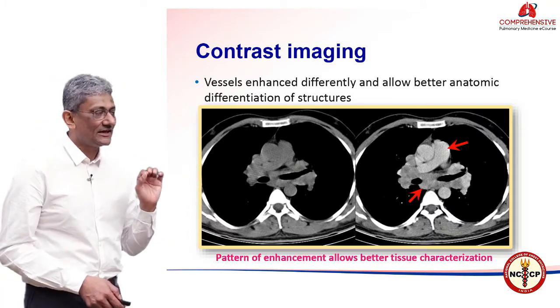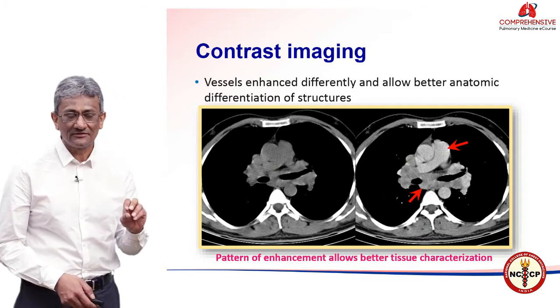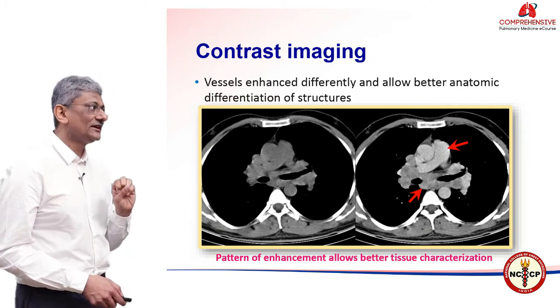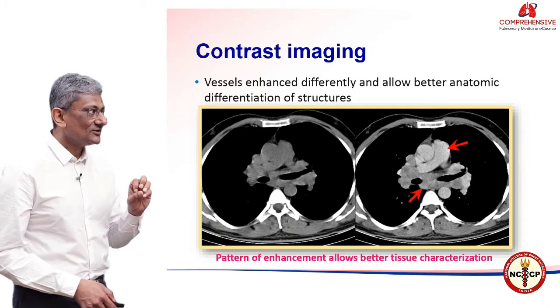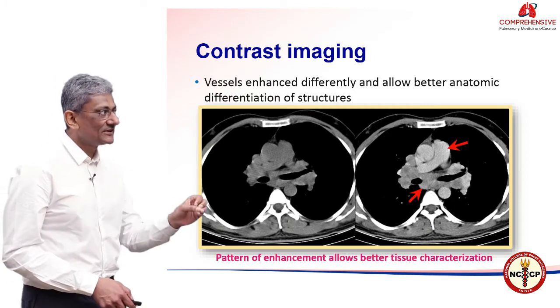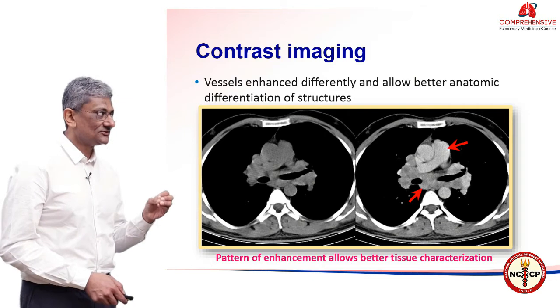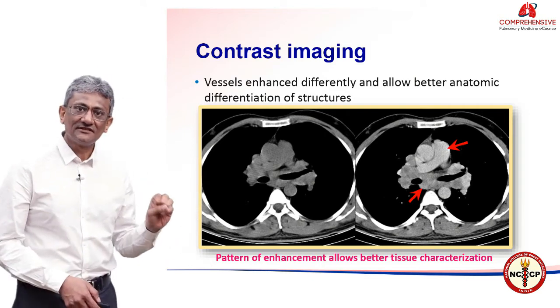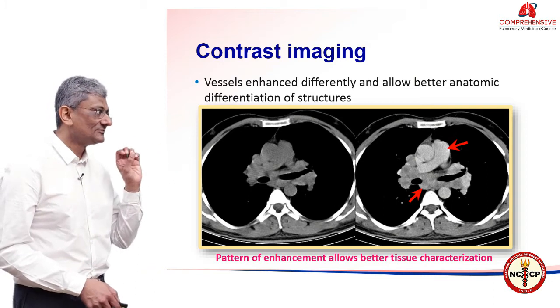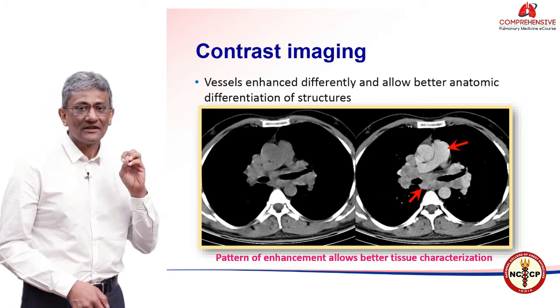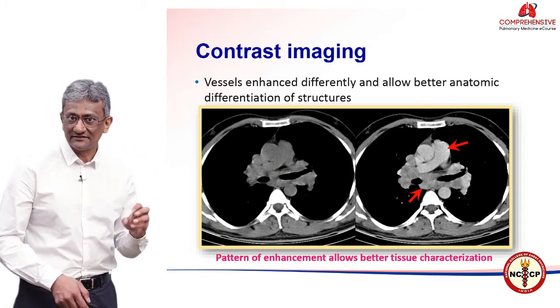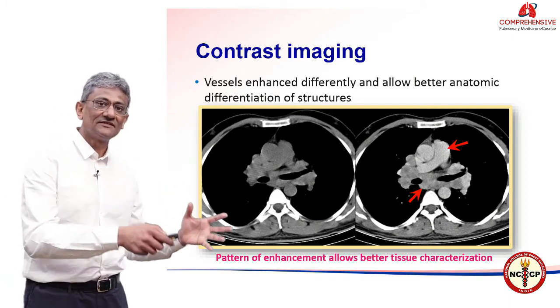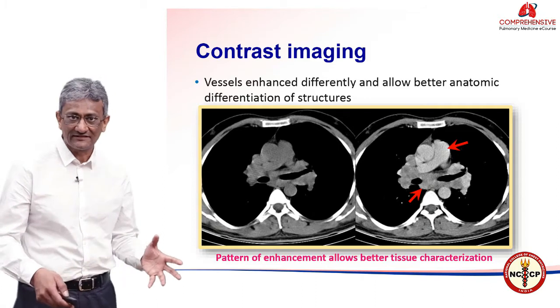On the right, the arrow points to the pulmonary artery which is opacified by contrast, and the arrowhead shows the lymph node which does not pick up the intravenous contrast to that extent and can be separately and easily distinguishable from the pulmonary artery. Since the vessels enhance differently after giving contrast, we can separate out the vessels from the other structures in the mediastinum.